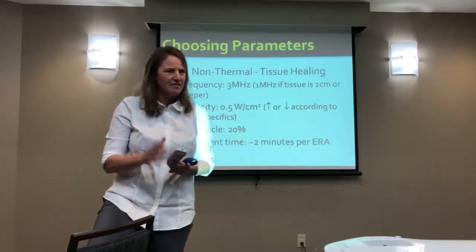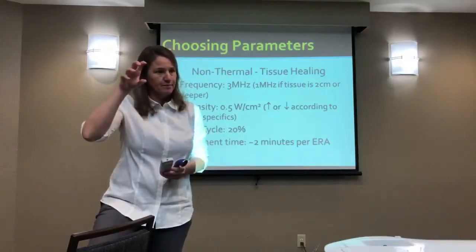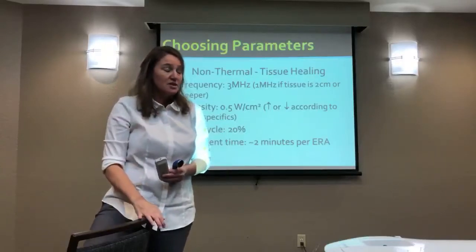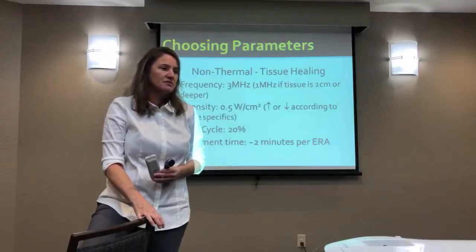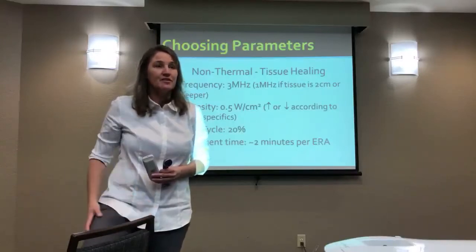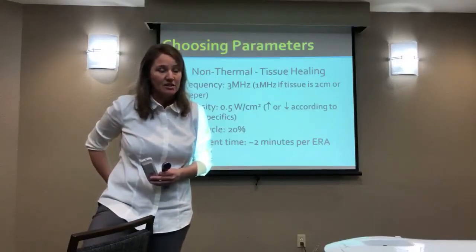If I had a really firm, bulging varicose vein, I would go adjacent to it if I could, not right over it. That's a good question. I've never had that asked before. Sometimes you go around on the leg and you see those varicosities, but they say, "I've had it for years and it doesn't bother me." A varicose vein off the top of my head doesn't jump out at me as a contraindication.